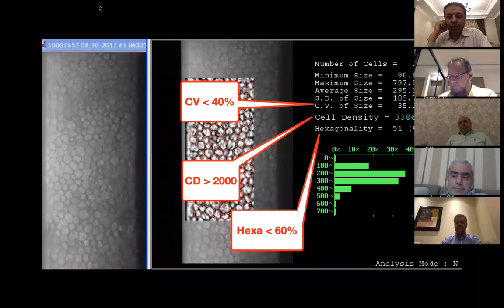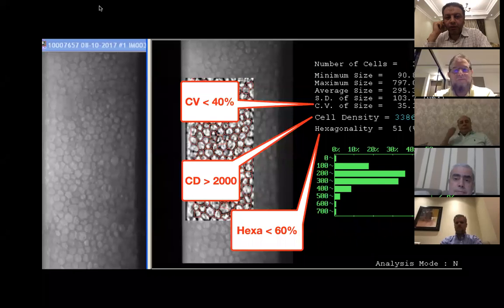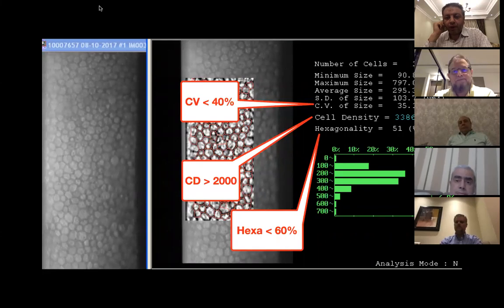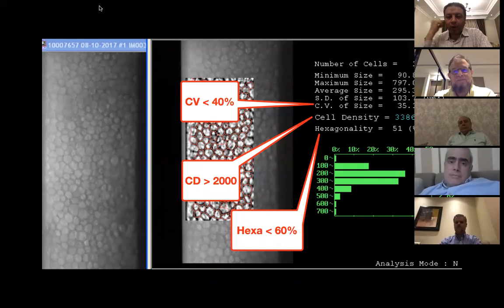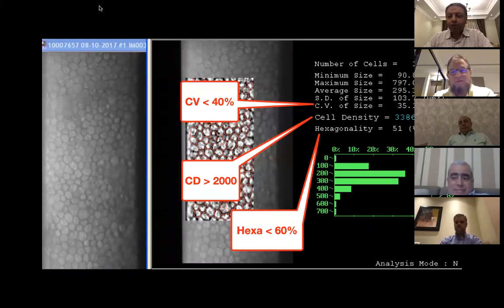This is a question which we discussed before, Dr. Mahmoud, about the surgeon who went for phakic IOL for just -2 diopters in a patient with thin cornea. Dr. Mazen, if you have such a case, what would you do? A patient with thin cornea, all the parameters are okay, but the cornea is thin, 455 micron at the thinnest location, with -2 diopters.